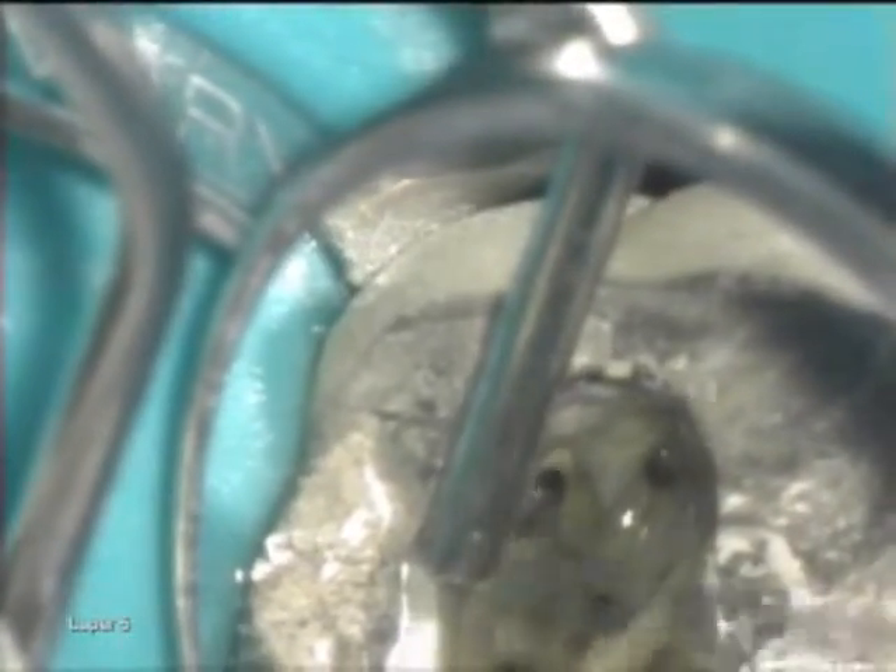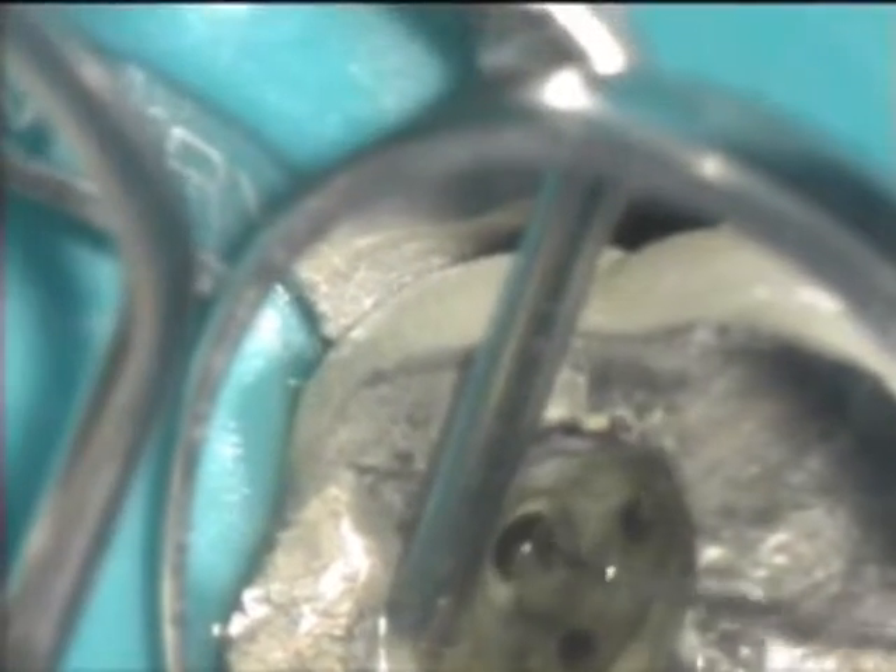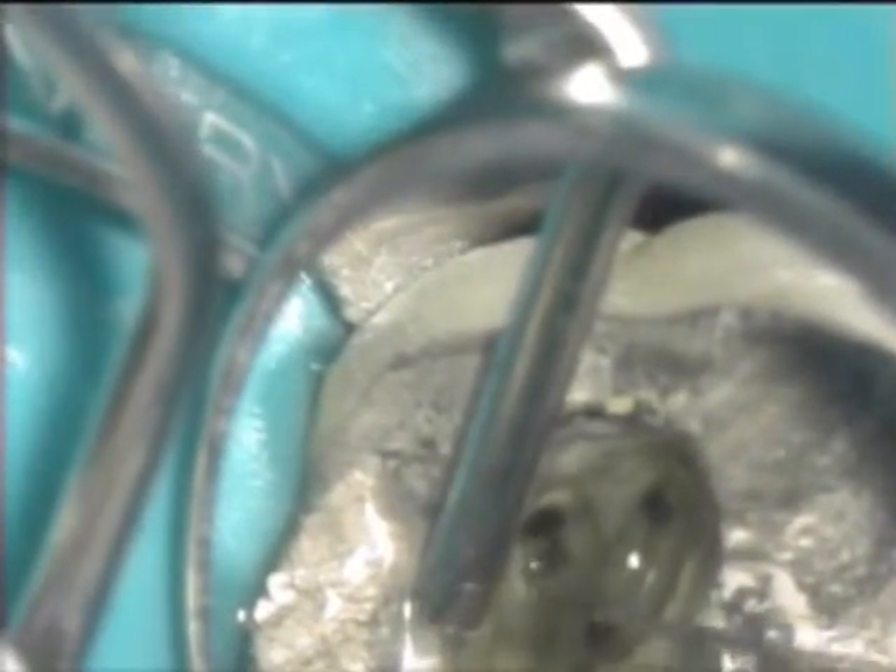This four-canaled molar was fully instrumented with ProTaper instruments. Full-strength sodium hypochlorite was utilized throughout the instrumentation procedure.